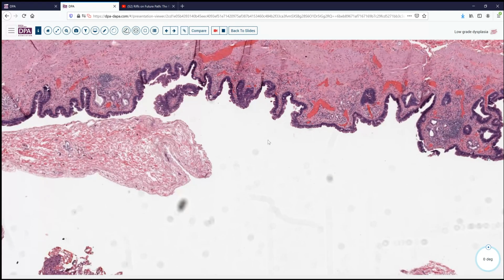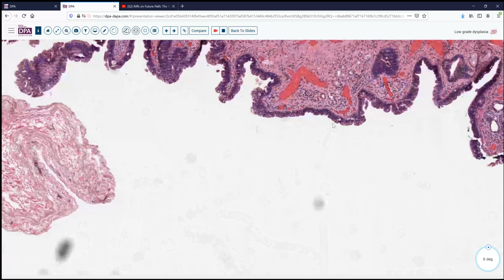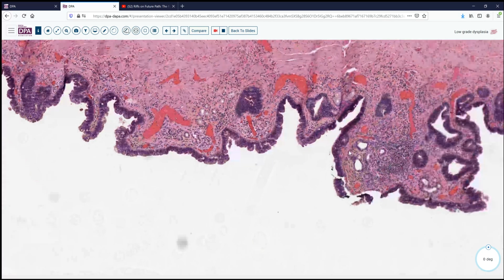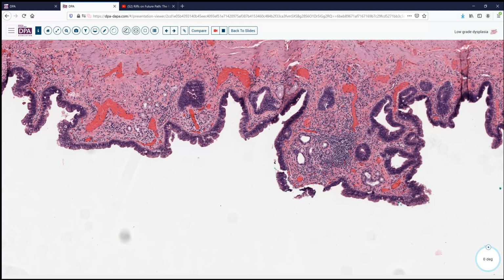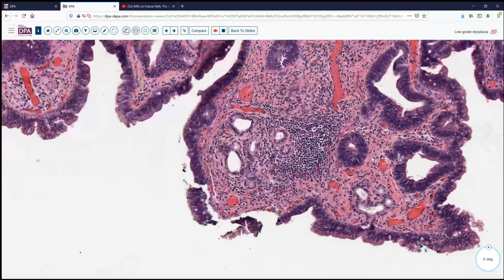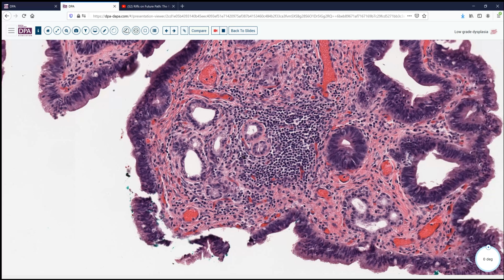That's certainly on the gross side of things. Microscopically, it's less of a problem if our index of suspicion is appropriate. First of all, we can see that the glands become hyperchromatic. And so hyperchromasia, particularly in the setting where you may have associated submucosal or intramucosal glands without that degree of hyperchromasia, is a very useful marker.